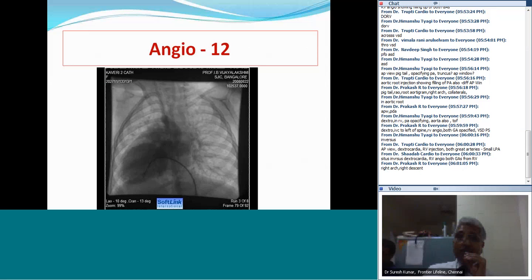The angiogram is done with the venous catheter. So it is in the venous ventricle. What is the morphology of the venous ventricle? It's a smooth walled ventricle. So the venous catheter goes into the smooth walled ventricle, which has to be anatomic left ventricle. So if the venous catheter enters the smooth walled left ventricle easily, there is an atrioventricular discordance.